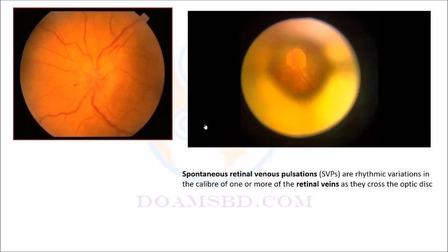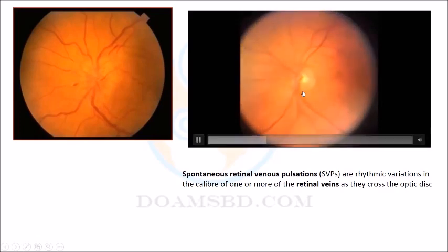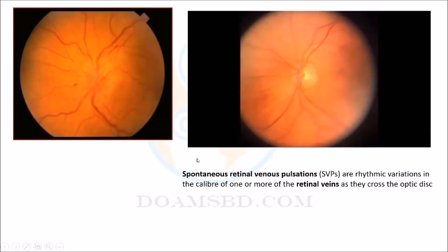No, sir. Spontaneous, no, sir. Do you like to see? Just a few seconds. Look at the center. Look at this. Can you see that pulsation is there? Yes, sir. It is called spontaneous retinal venous pulsation.